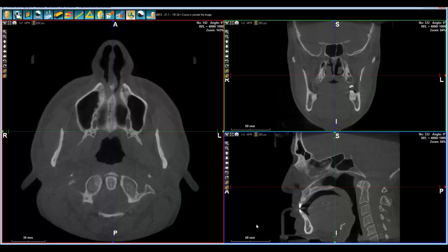WhiteFox is not only for dental. You also have some nice applications that are dedicated for ENT. Ears is one of them, and the other one is Airways. You can analyze Airways with WhiteFox.